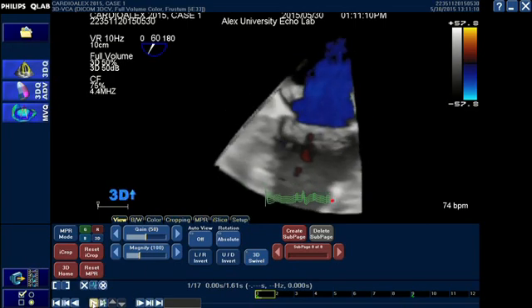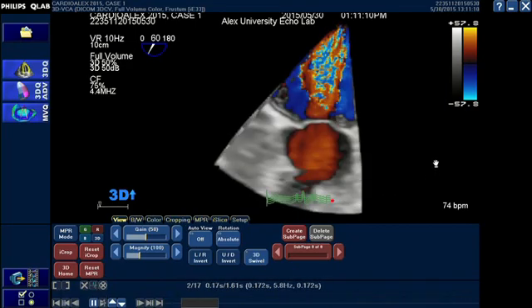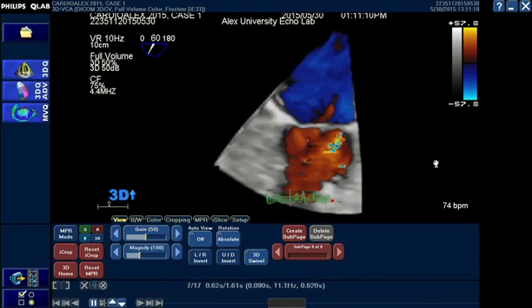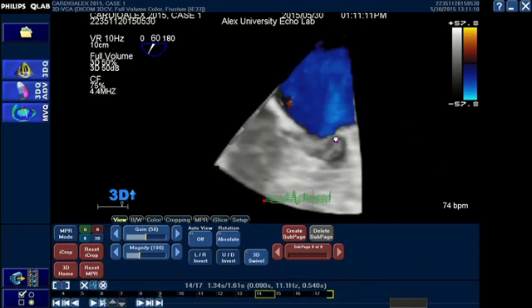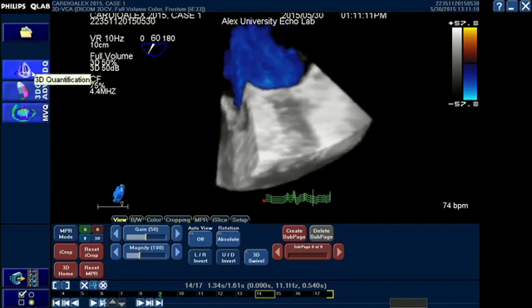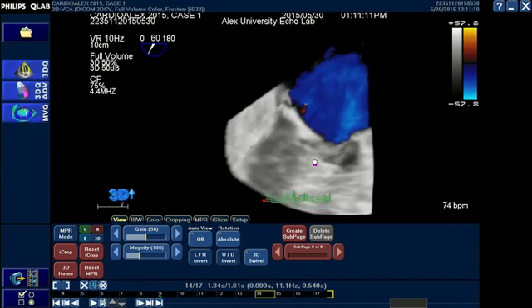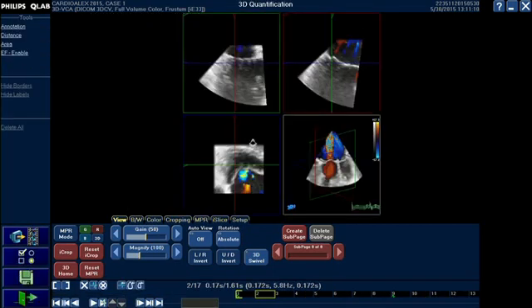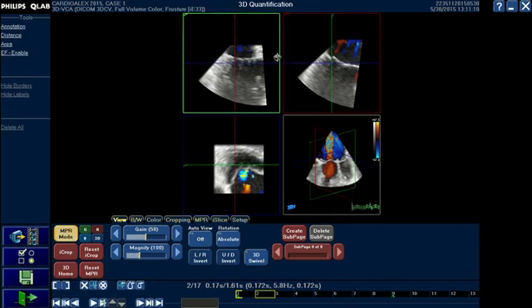Here we can click the play button to make it play, and as mentioned in our previous videos, we can make it play and stop by just clicking the space bar. The Q-Lab shows us the tools by which we can quantify or work on this particular volume. In this video I'm going to show how to use the 3D quantification tool to measure the 3D vena contracta area. By clicking this tool we will see the MPR mode — Multi-Planar Reformation mode — and as mentioned previously, we have four different boxes.